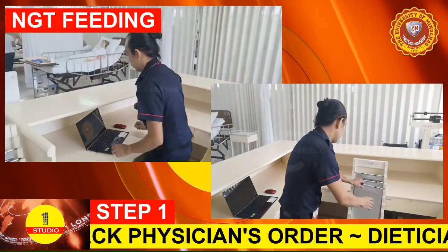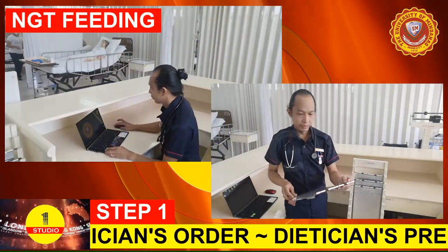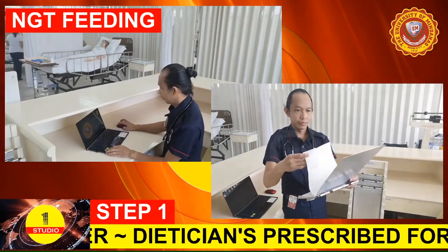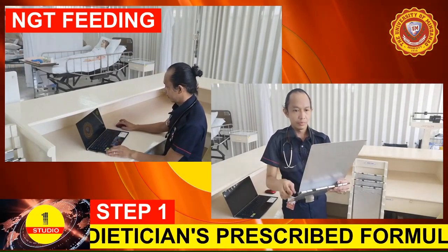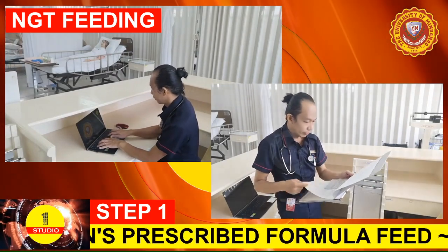Step 1. Check the physician's order or the dietitian's prescribed and calculated formula feed in the client's medical chart or electronic health record.